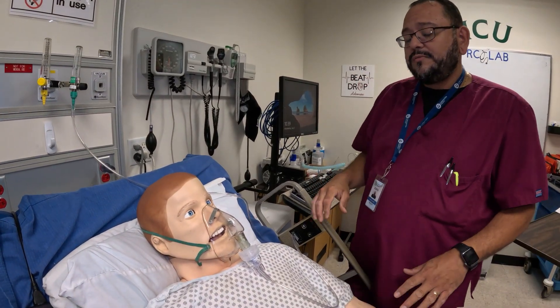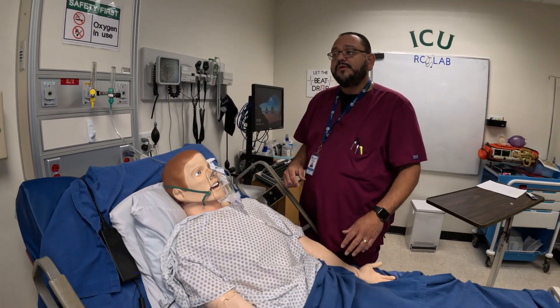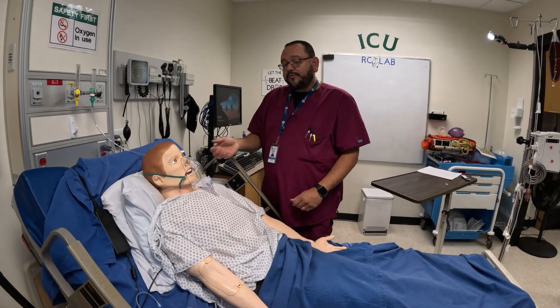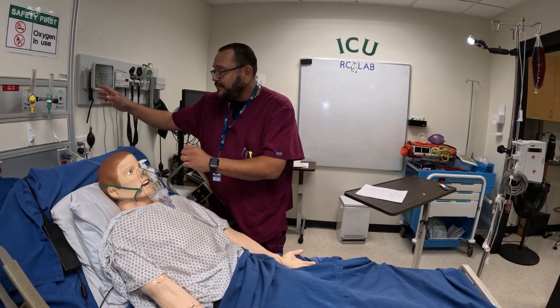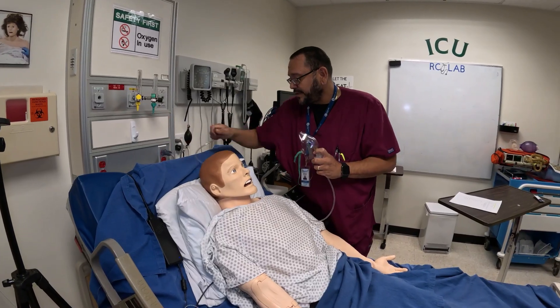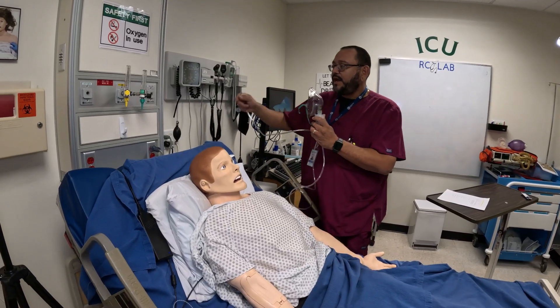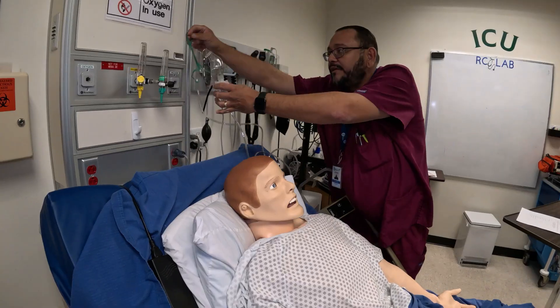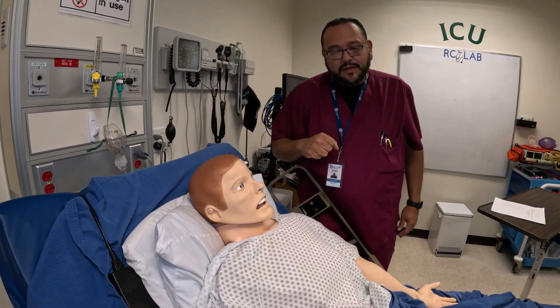Of course, you want to check vitals — that should be something you do before and after. So we want to make sure we check heart rate, breath sounds, respirations, and the SPO2. After we're done with this, we thank Mr. Smith and go ahead and take post-vitals. So I'm going to take everything off. Thank you very much, Mr. Smith. A lot of times patients will get additional treatments throughout the day, so you should have a bag for their equipment and this should go in the bag and be left at the bedside for future use. If any kind of dirtiness or anything, you toss it out and get a new one.